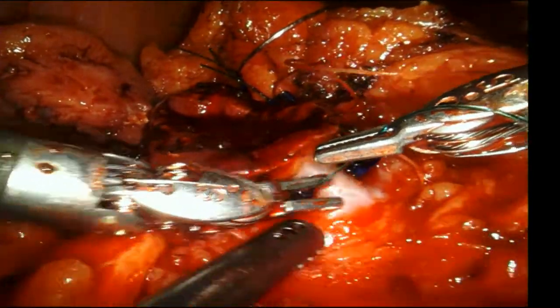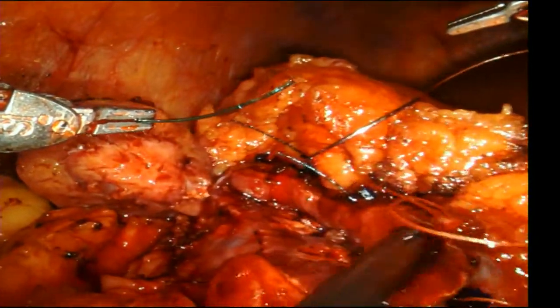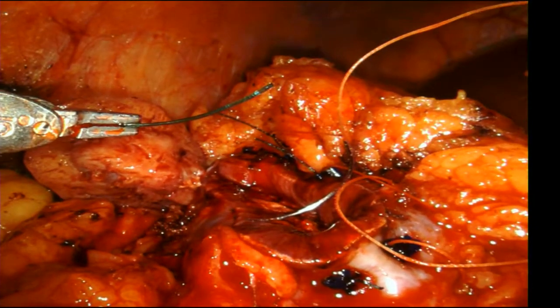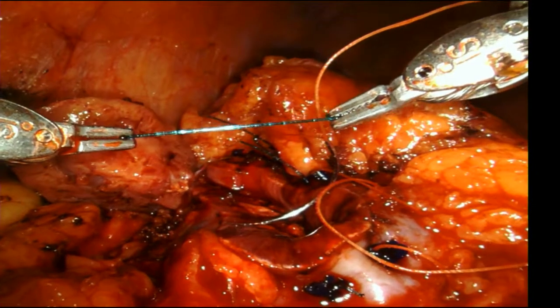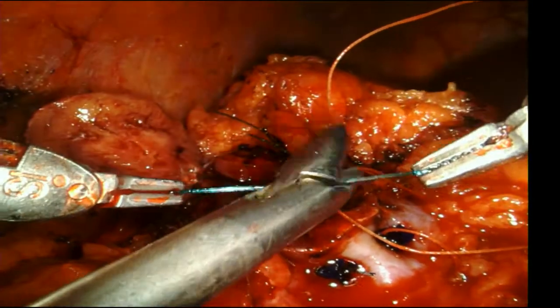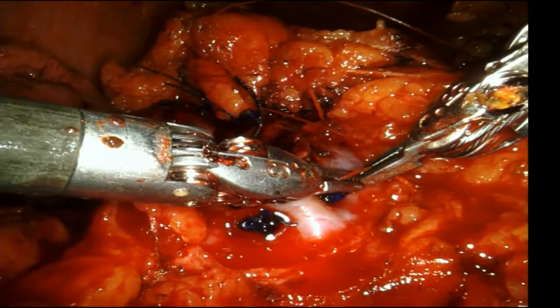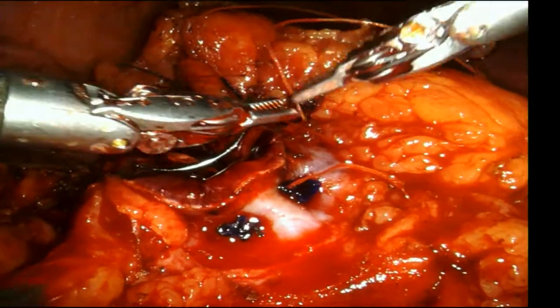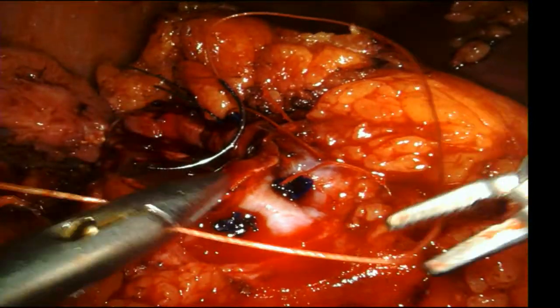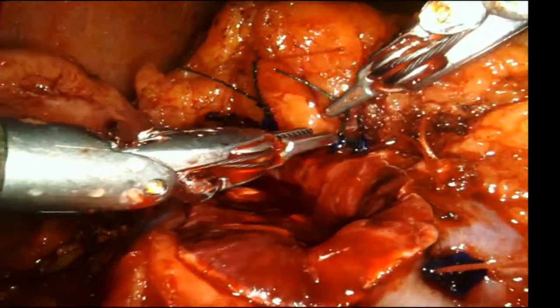Problem solved. Ronnie, have you tried Stratafix here? I haven't, no. I'm just curious. I didn't see any reason to switch from this, to be honest with you. I've always been using the V-locks for this and didn't see a reason to switch. But when we started doing the prostates, the Stratafix came out, and I said, man, I wasn't using the V-lock on the anastomosis for the prostates because I didn't like the sawing. And then when the Stratafix came out, I said, oh, I'm going to try this, and I really loved it. So I stuck with it. But yeah, I think the Stratafix would probably be good for this too, I just never switched. It's just always been on my card, V-lock.